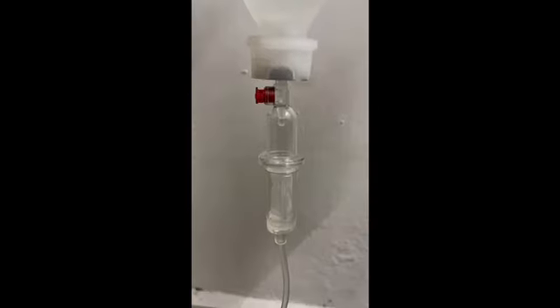Doc. If the second scenario occurs, which is the IV drip block, as we can see, the IV drip has a problem or blockage, and the system will give a notification to the nurse. First, the OLED will display drip block and it will display the notification to the nurse or doctor through the mobile app.